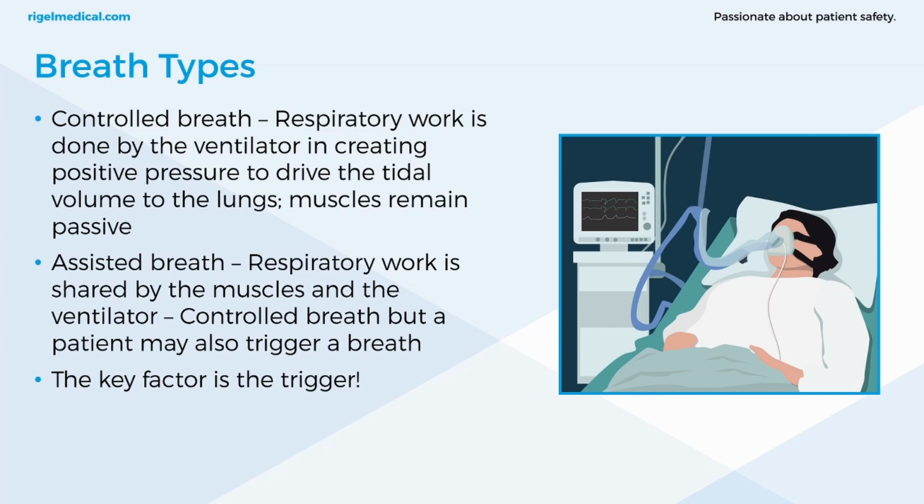Then we've got assisted breath, so respiratory work is shared by the muscles and the ventilator. It's a controlled breath, but a patient may also trigger a breath. And the key factor is the trigger. So some examples.